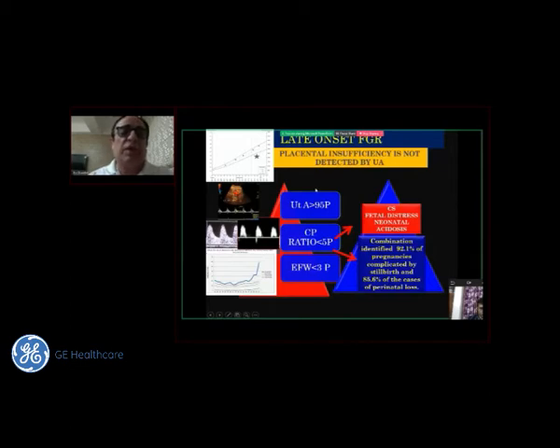So in late FGR, you can have changes which could be in the form of uterine artery Doppler, which could be above the 95th centile. By itself, if the fetus is less than third centile weight, you can see from this chart here that if you have a fetus which is less than third centile shaded in blue, then it is a very high mortality rate.